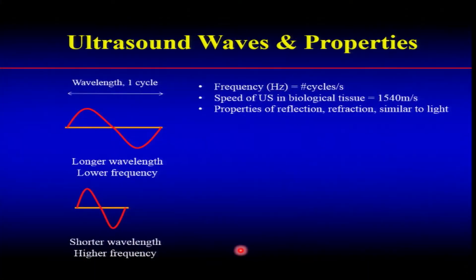And the properties of ultrasound are similar to any other wave, it could be light, it could be electromagnetic, it could be ultrasound, and it has the same properties of reflection, refraction, similar to light. So I did a little animation for you this time.